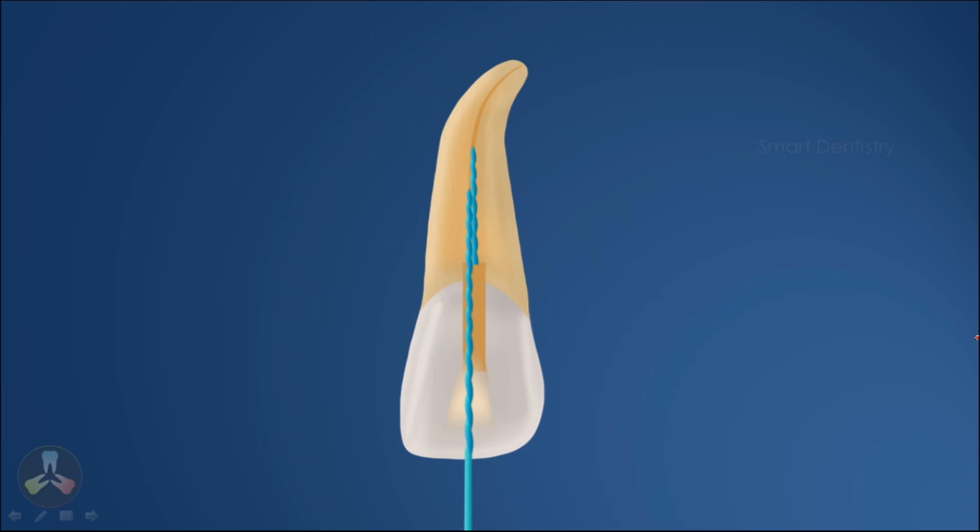But in certain situations, we will be able to bypass the fractured file and we may be able to go till the root apex. But the fractured segment of the file will never come out. It will be entrapped in between. But it is not a problem. If such a situation comes, and if you could go till the working length, leaving the file in the root canal is harmless. The success rate will never be compromised. If we could go up to the apex, we could do a proper cleaning and shaping and we could obturate.